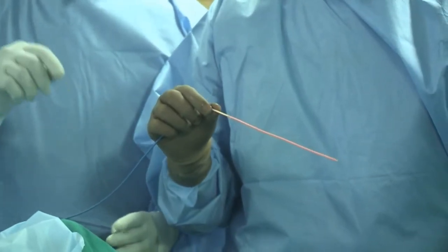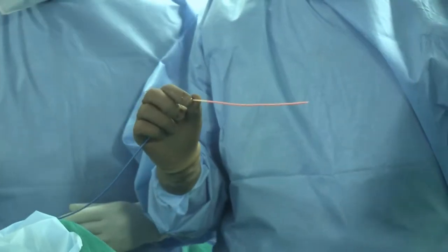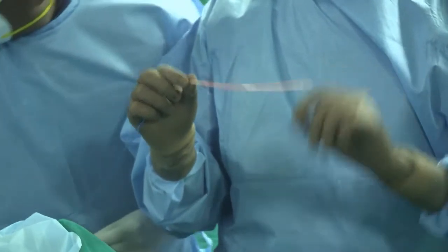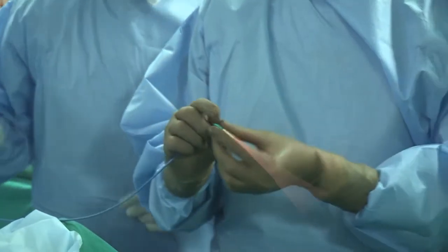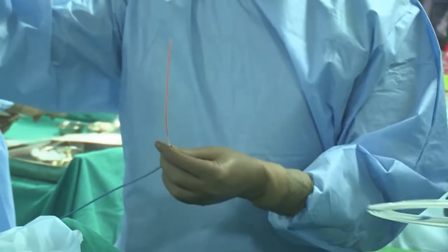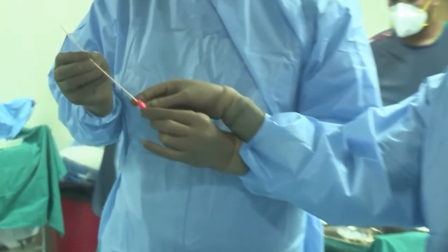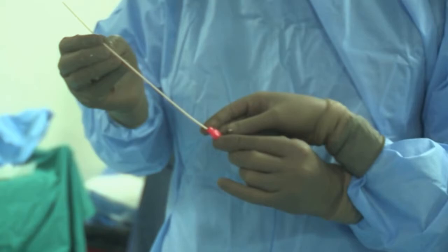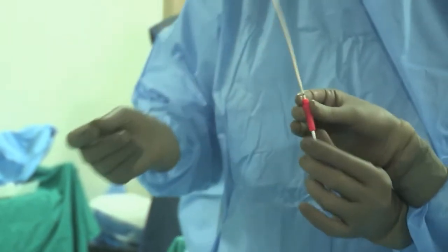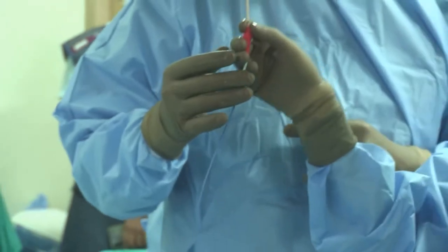Can you focus on the radial artery? So this is the 5 French radial I've already taken. And once I have removed the 5 French sheath, I'm going to insert this. So let's do that. We are pulling it till we get this black marker here. This is a 100 centimeter guide. So this is the first marker which is seen. So we have taken this out, and our system is ready to be inserted now.